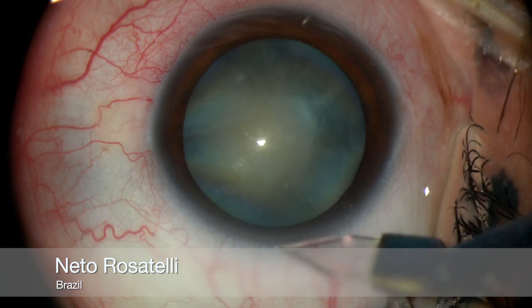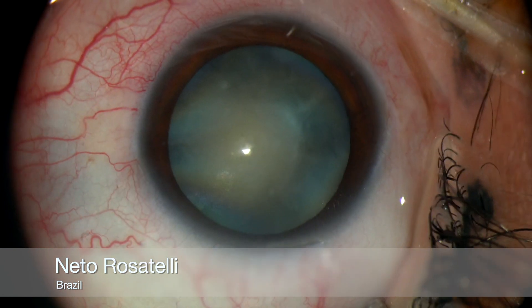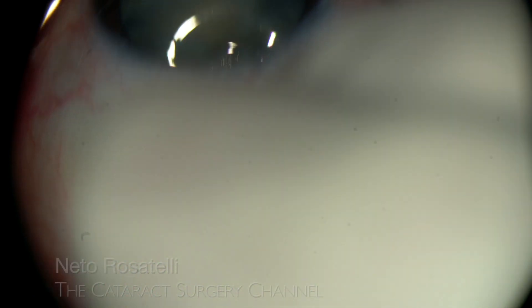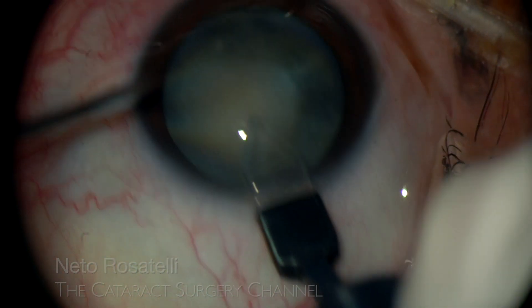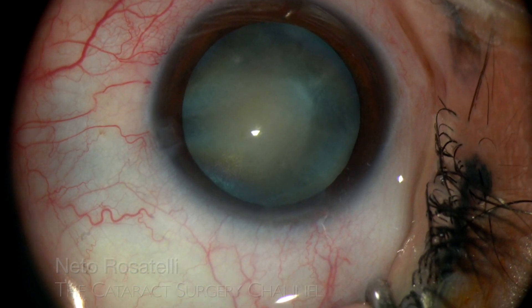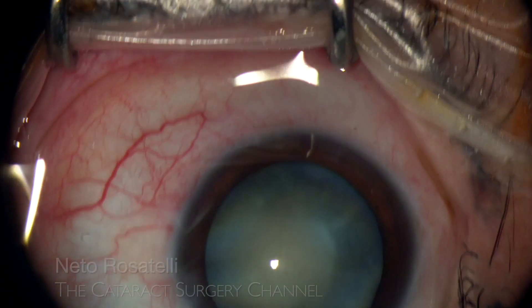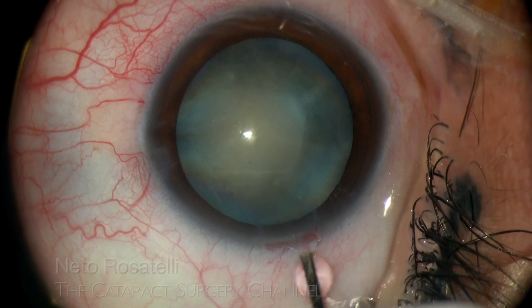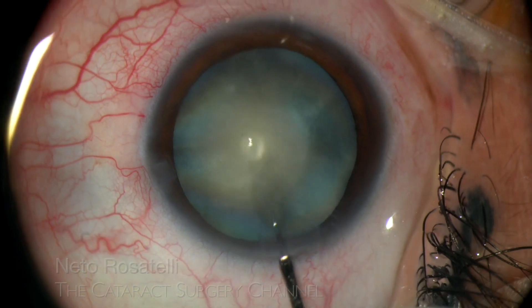A groove is made with the side of a 2.8 sapphire knife to achieve a nice triplanar incision. The side port is done with a 21 gauge needle, the blunt edges of the sapphire knife holding the eye steady. The eye is centered and 0.5 lidocaine followed by Trypan Blue are injected.